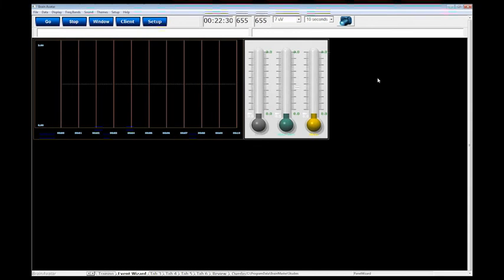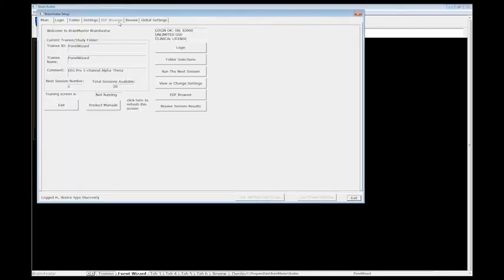Okay. Like I said, I think if you could get that information on the listserv. Absolutely will. Thank you very much. Sure. Do we have anything else? Rob, is it possible to run this screen so we can see what it looks like? Probably. I don't have anything hooked up, so give me one moment.